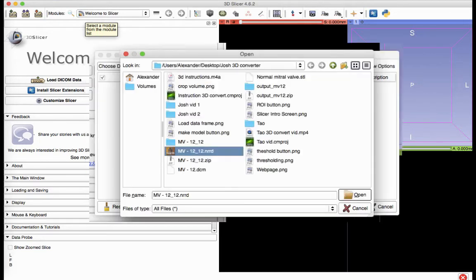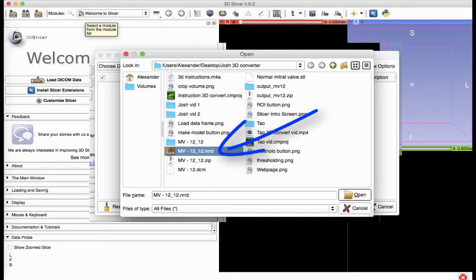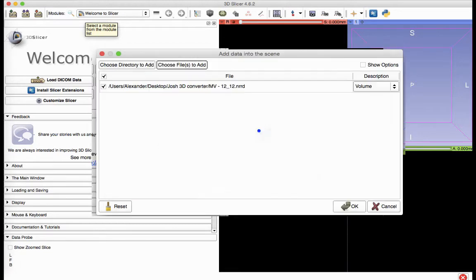Select the NRRD file. Then click Open. Now select OK to load the data into Slicer.